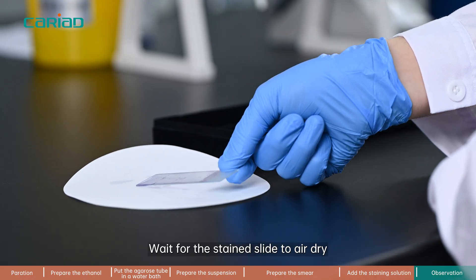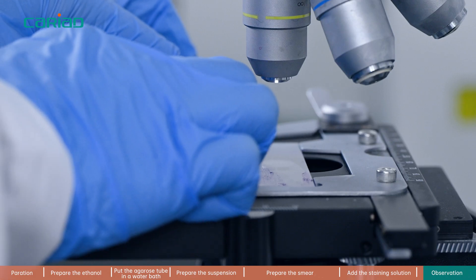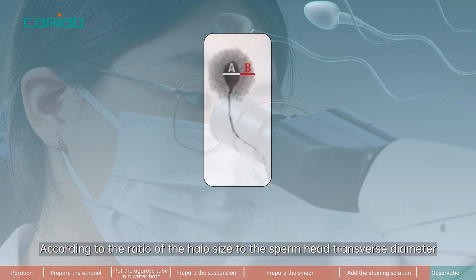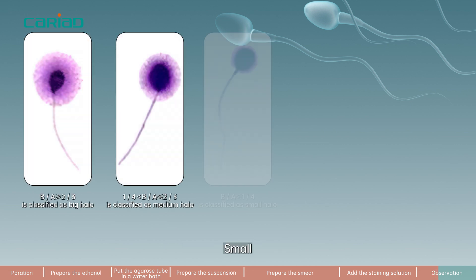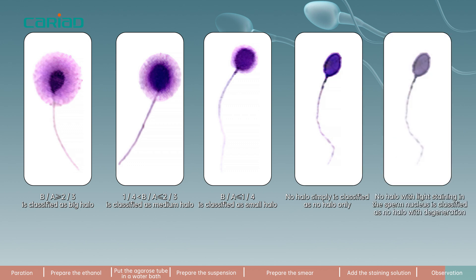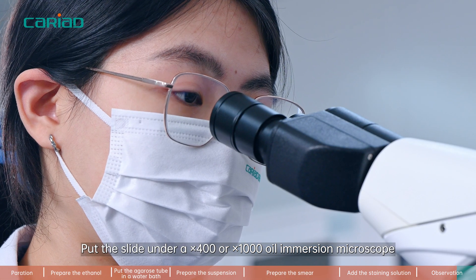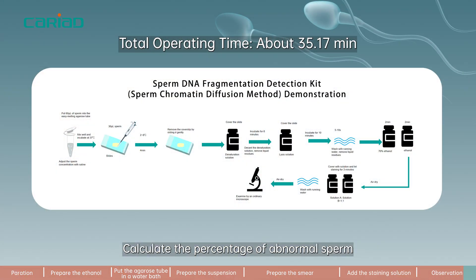Step 10. Wait for the stained slide to air dry. Put the slide under the microscope and count the sperm with halo. According to the ratio of the halo size to the sperm head transverse diameter, there are five grades: large, medium, small, no halo, and degeneration. Put the slide under a ×400 or ×1000 oil immersion microscope and count 400 sperms. Calculate the percentage of abnormal sperm with small halo, no halo, or degenerated halo.